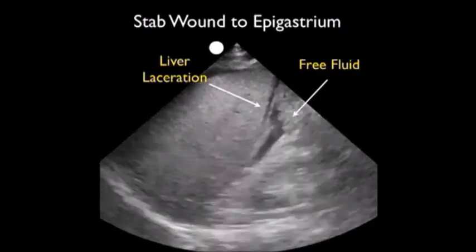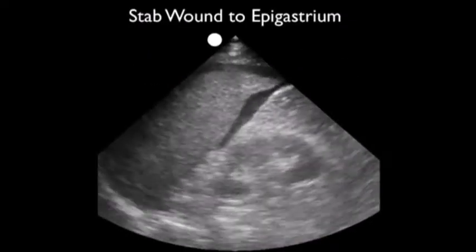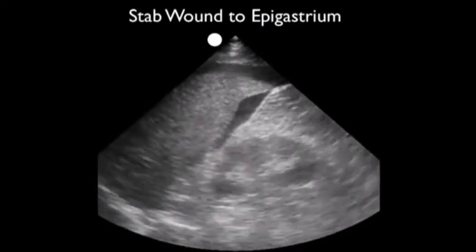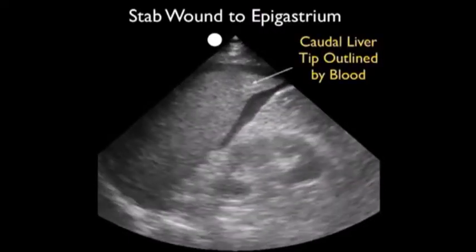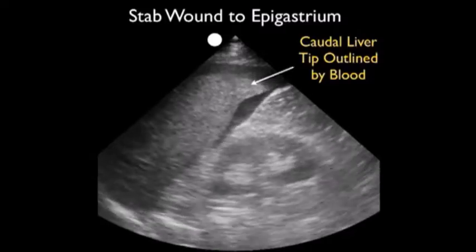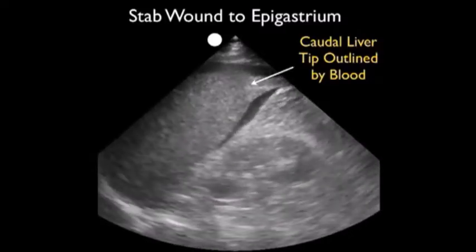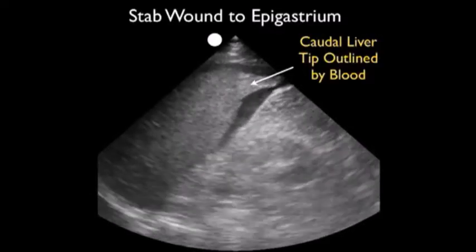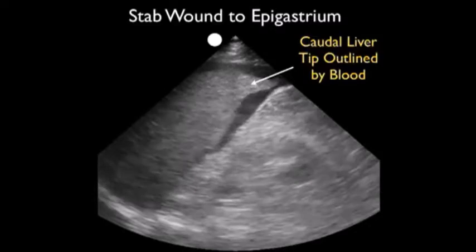As this patient had unstable hemodynamics, the next move was to package for the operating room. Here we can see the caudal tip of the liver waving around in all the fresh fluid — in this case blood. I obtained this view by moving the probe one intercostal space inferior from the last view to well delineate that caudal tip of the liver, which we can see moving around in all the fresh fluid.